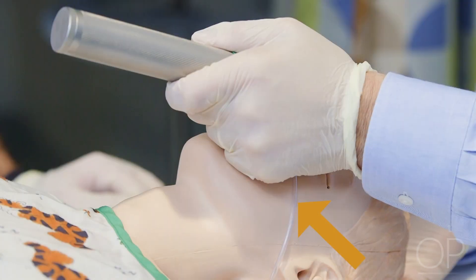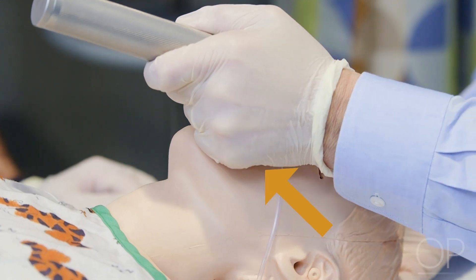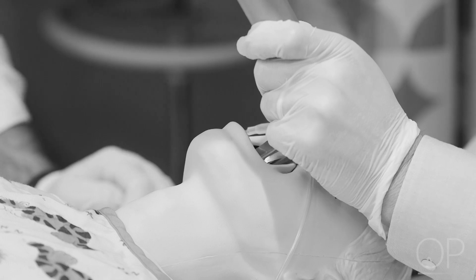The laryngoscope handle should be lifted forward and upward to obtain a view of the glottic opening. Do not rock the handle and blade or press against the gums or teeth.